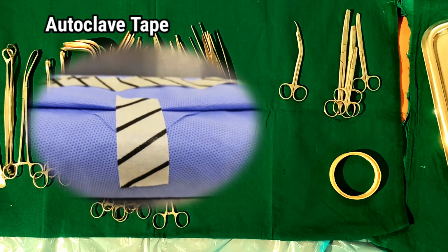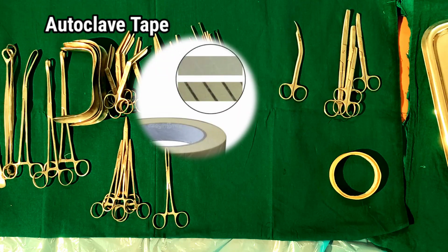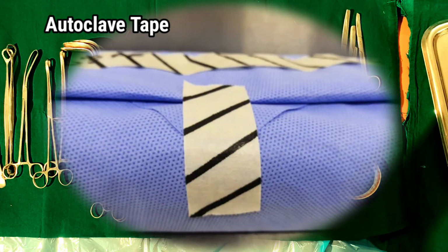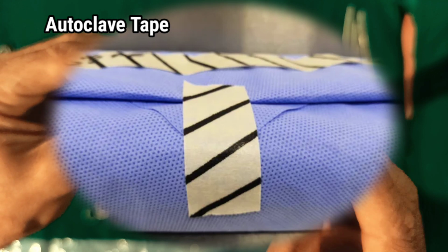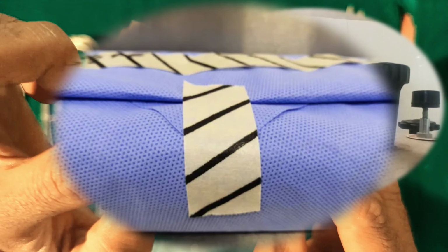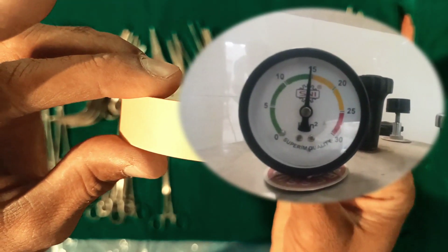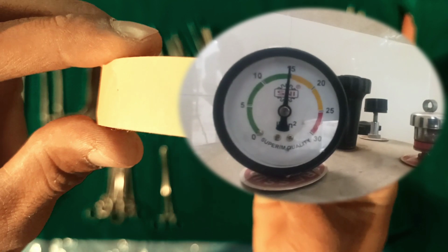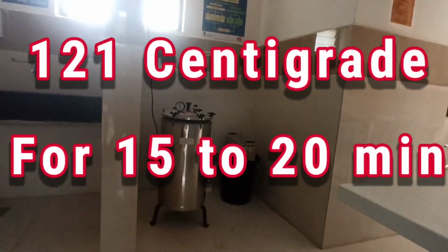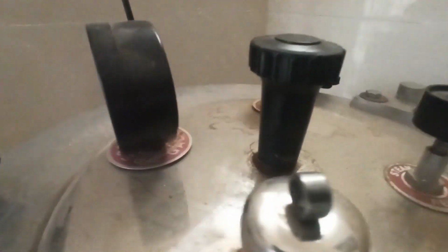The tape is similar to masking tape but is slightly more adhesive to allow it to hold under the hot, moist conditions of the autoclave. One such tape has diagonal markings containing an ink which changes color, usually to blue or black, upon heating. It is important to note that the presence of autoclave tape that has changed color on an item does not ensure that the product is sterilized, as the tape will change color upon exposure only. For steam sterilization to occur, the entire item must completely reach and maintain 121 centigrade for 15 to 20 minutes with proper steam exposure to ensure sterilization.